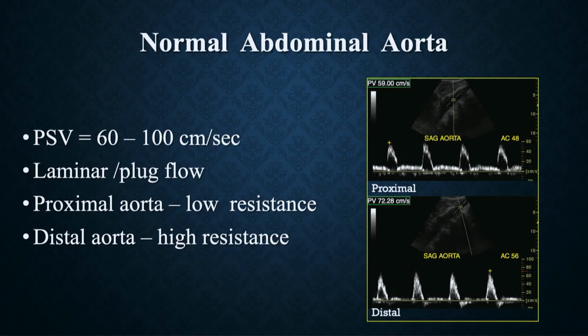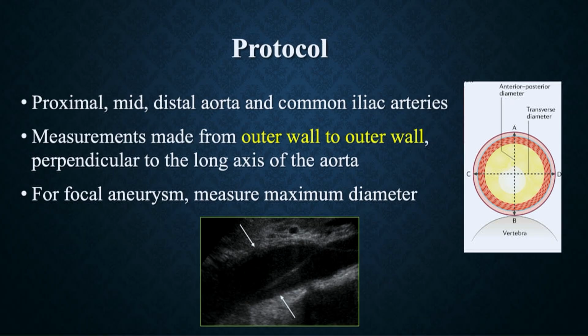in time. And reiterating again, proximal aorta, low resistance waveforms, looking at the sample on top, continuous diastolic flow because it's feeding the celiac and the renal arteries. Once we get below the renals, then it's feeding the lower extremities, high resistance, and we'll have diastolic reversal.